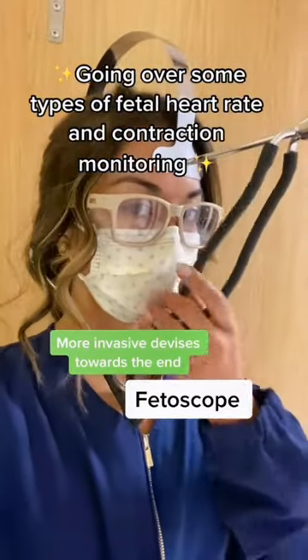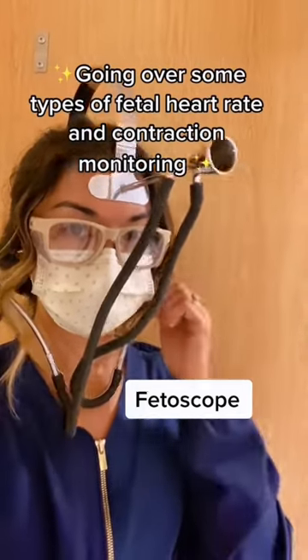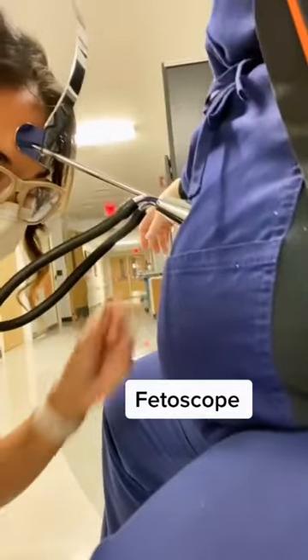This is a Fetoscope. It is a device used prior to electronic fetal monitoring to listen to baby's heart rate. This goes against the mother's belly like so.